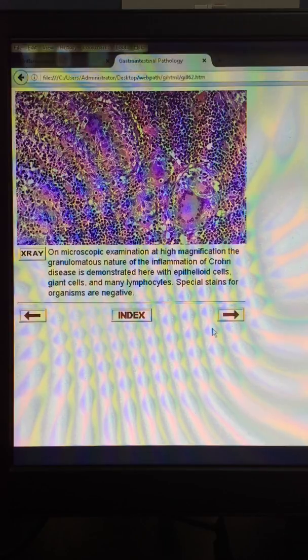Crohn's disease. In case of granulomatous inflammation within the colon, we have to consider infection as a differential diagnosis, and we have to run special stains to detect any microorganisms like fungal, bacterial, or mycobacterial elements.